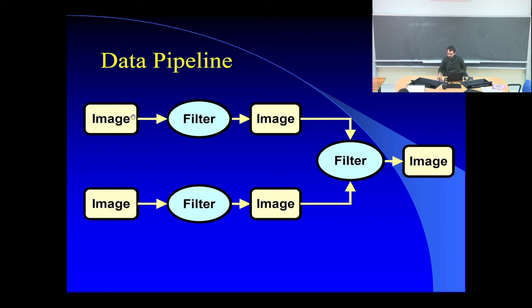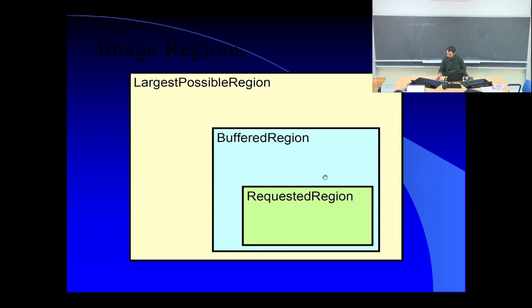This loading an image will be a block or an object called image reader. Okay? This will involve the filter. This will be involving another filter, and this probably will involve image writer. Something that will write the image into the specific file. Okay? So this is a typical example. Well, I'll skip this, but you can say from an image you can use the full image, you can use a small part of the image, you can use several things as well. Okay?